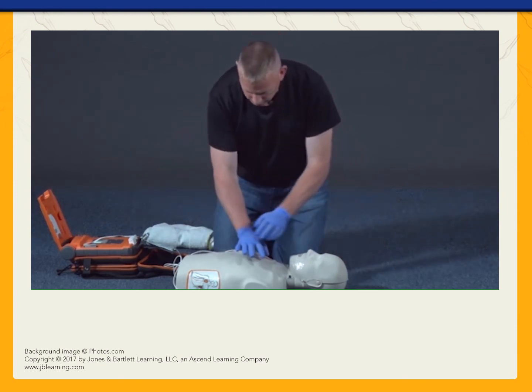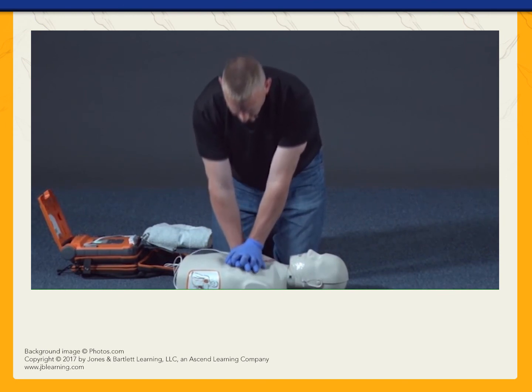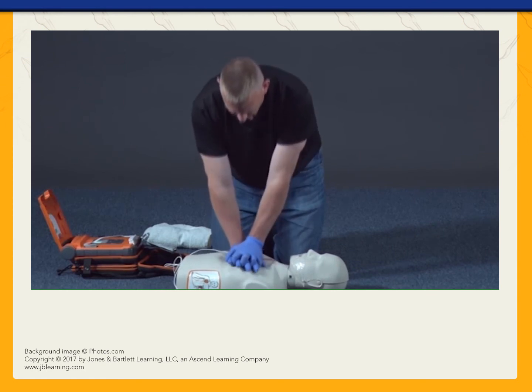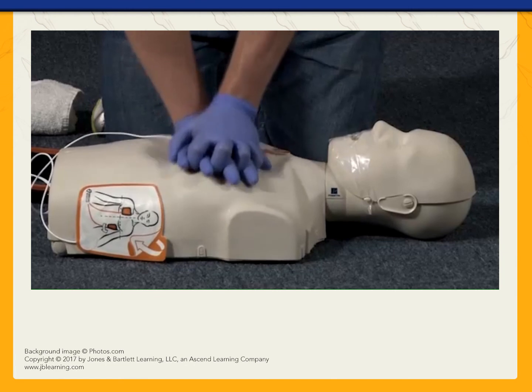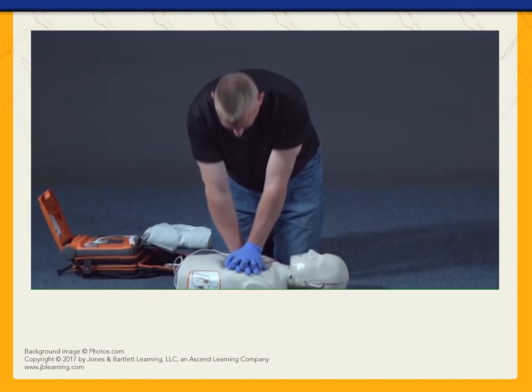Start compressions. Give 5 sets of CPR or follow the AED's prompts unless the person moves, begins to breathe, or wakes up. Continue using the AED and CPR until the person moves or begins to breathe or until EMS takes over.